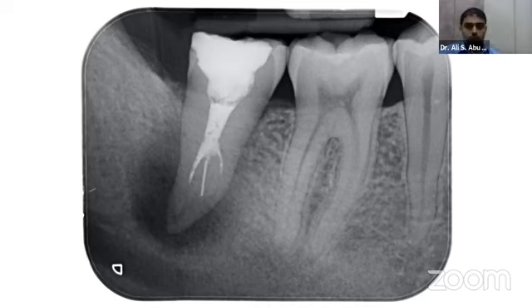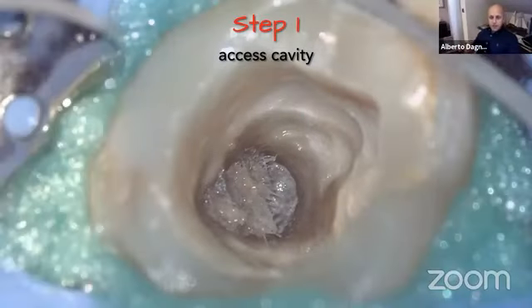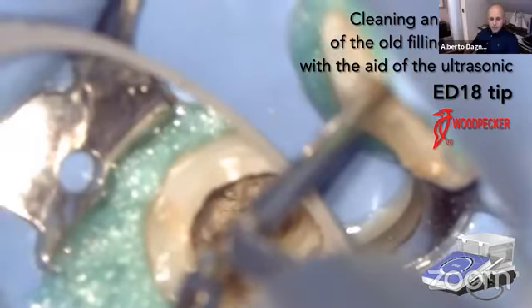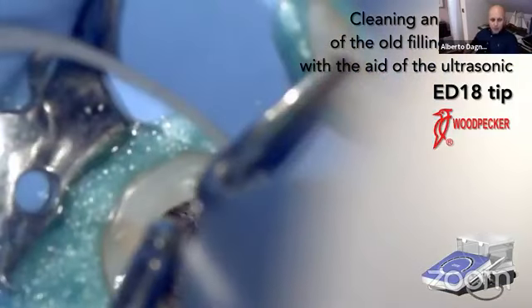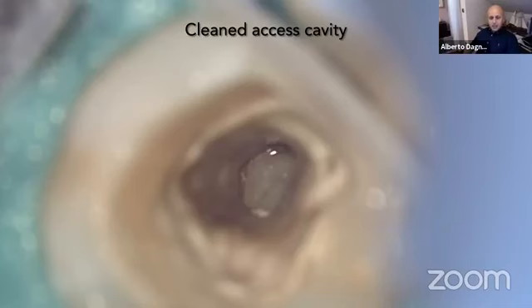Okay. Thank you. Okay, this is a second molar with an original anatomy, in which I find this broken file in the middle third of the root. The first step is to reopen the access cavity and to remove all the filling materials, and with the ultrasonic tips, in this case a short tip made to clean the coronal portion of the tooth and of the canal, I remove all the old material. I go quick. I clean all the material, and I discovered the head of the broken file.